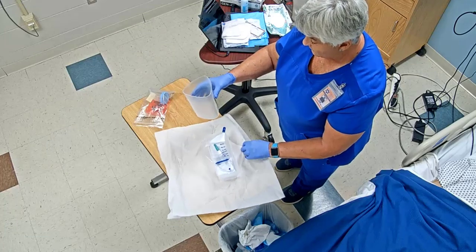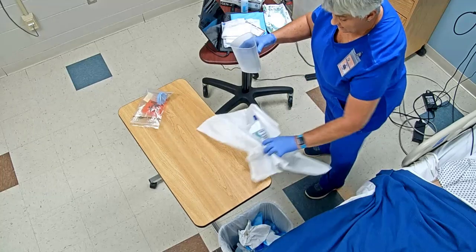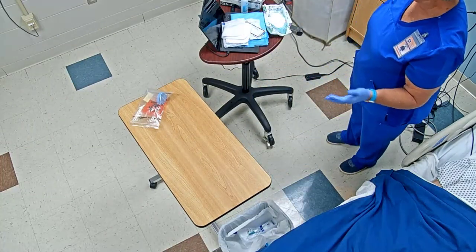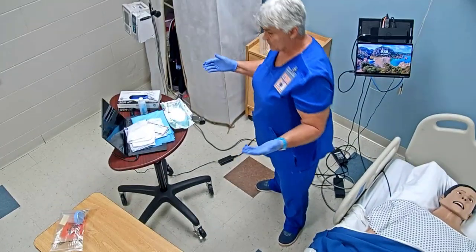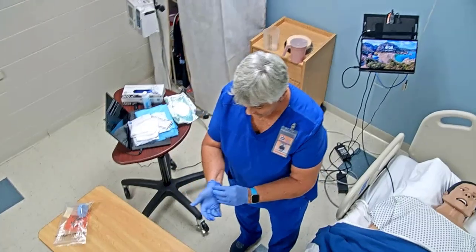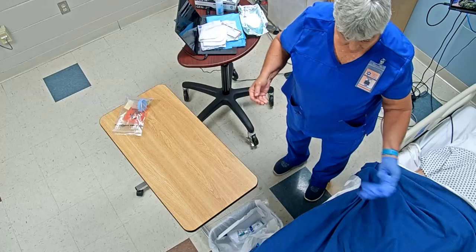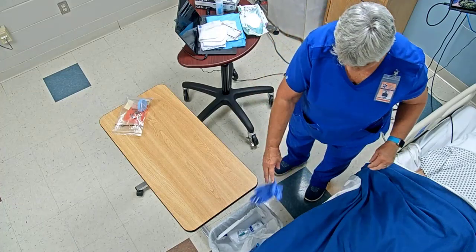With all of this, I'm going to take this, dump it into the commode, rinse it out, and leave it in the bathroom in case we have to keep checking how much he's urinating.